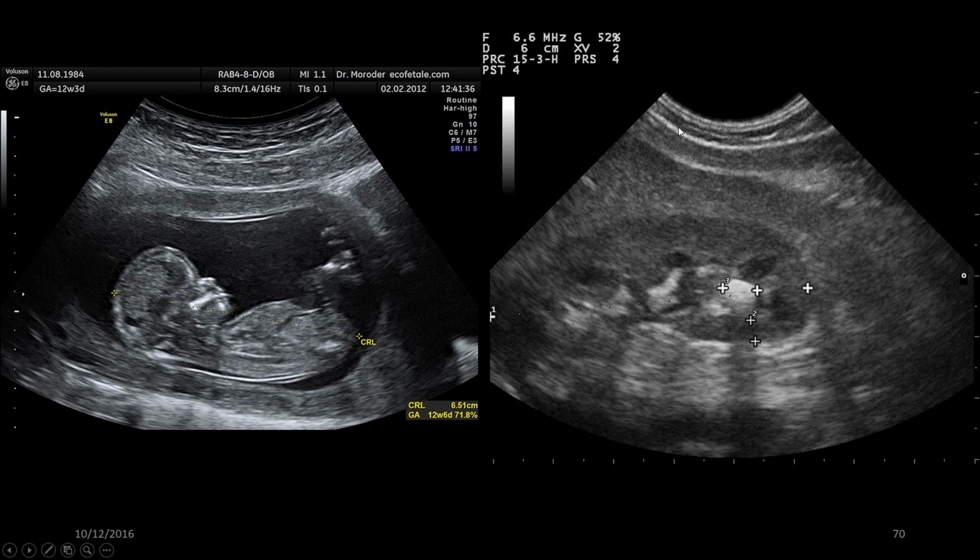And the reason that we know it's a kidney stone is that you've got all these echoes, these very grey lines, and you've got changes in density depending on how quickly it bounces back. And so what you can see is very, very bright, a very loud echo coming back. But at the back, you're not getting anything coming back from there.